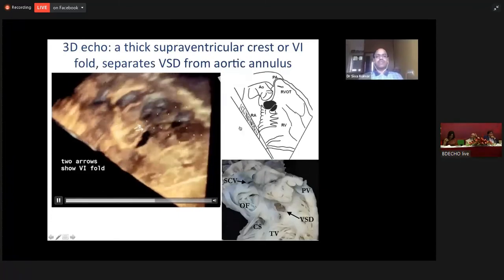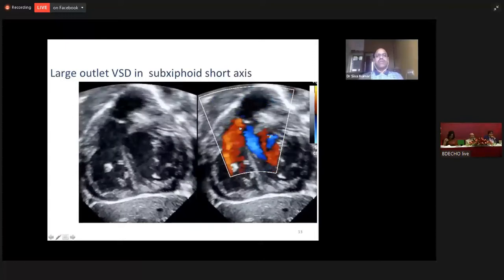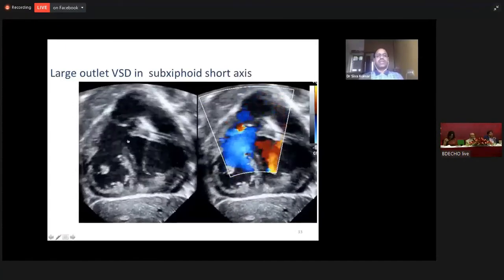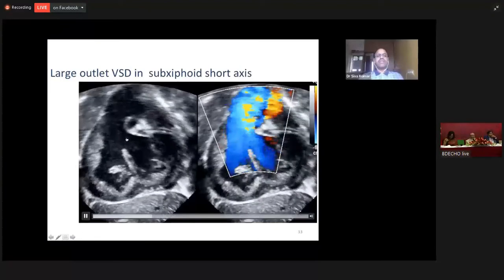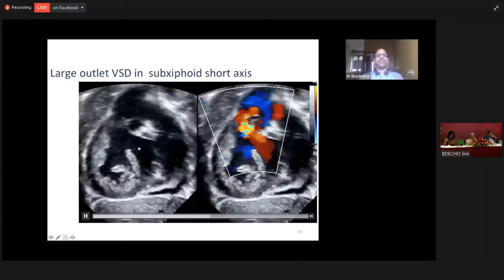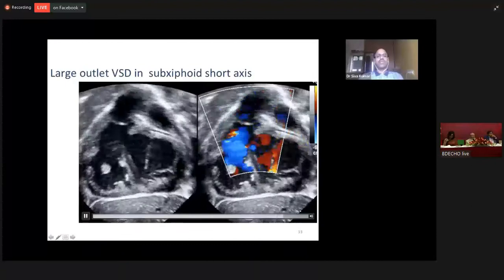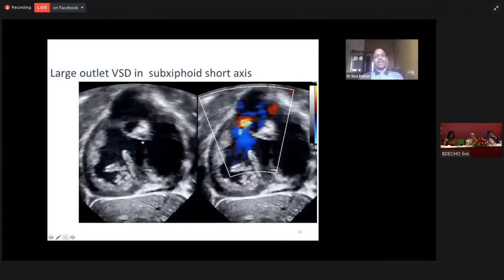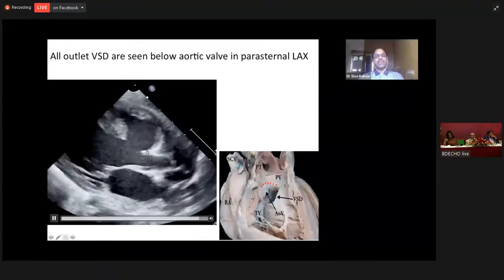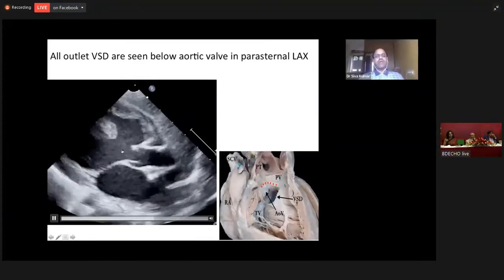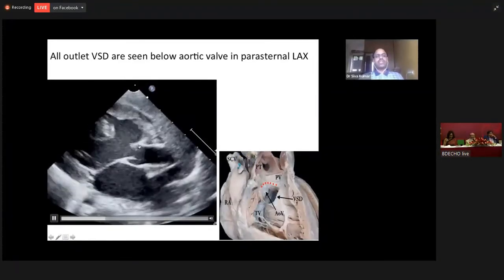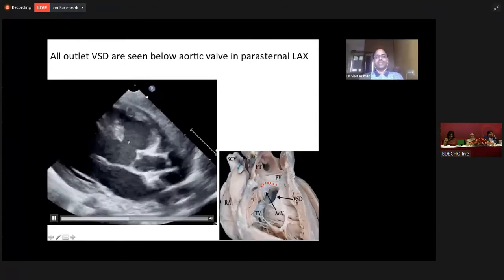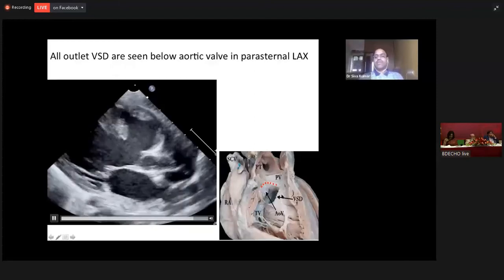Coming to outlet septal defect: in a subcostal short-axis view, the ventricular septal defect located immediately below the pulmonary valve is the outlet VSD. So this is the outlet VSD — a large outlet VSD. When you look at it in a parasternal long-axis view, it is located below the aortic valve. Whatever is seen on a parasternal long-axis view below the aortic valve is an outlet VSD — a large outlet VSD with a cartoon example, located immediately below the pulmonary valve.